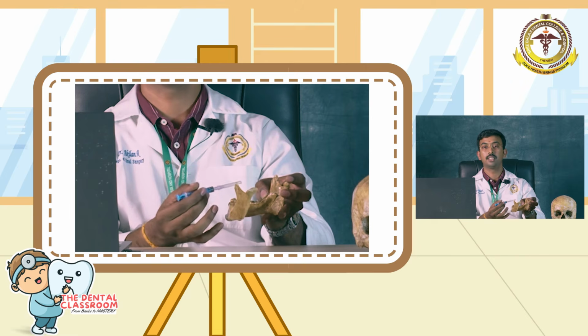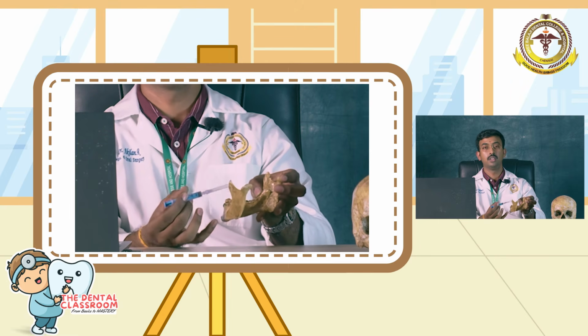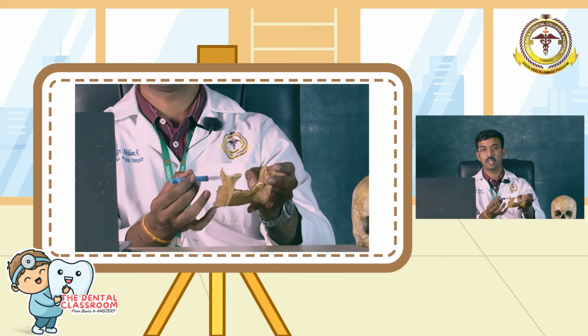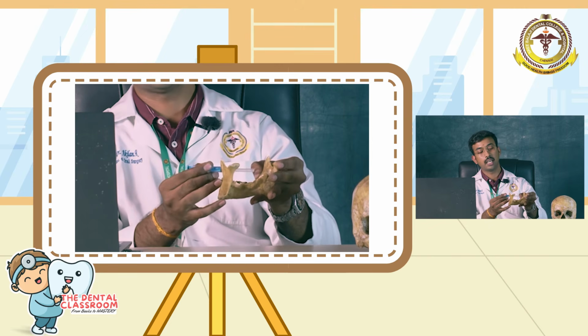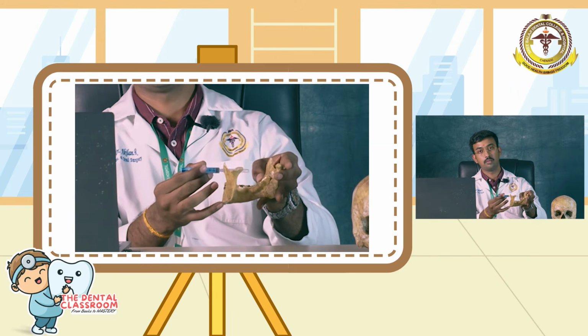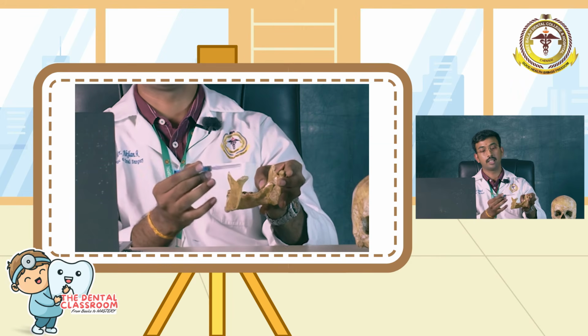that is from the left side, preferably over the premolar or the corner of the mouth, with the syringe barrel placed parallel to the mandibular occlusal plane and having an imaginary bisecting line of my thumb finger. Without adjusting my thumb, I will start inserting my needle.